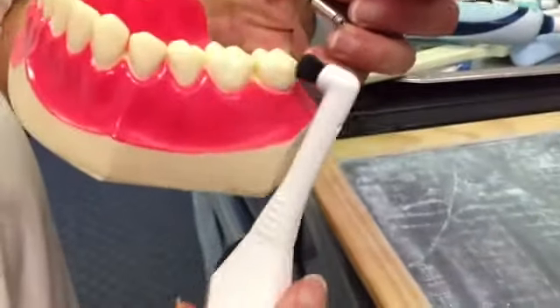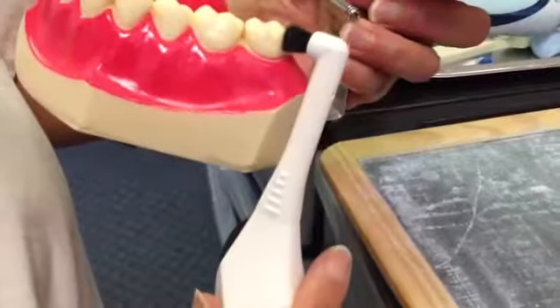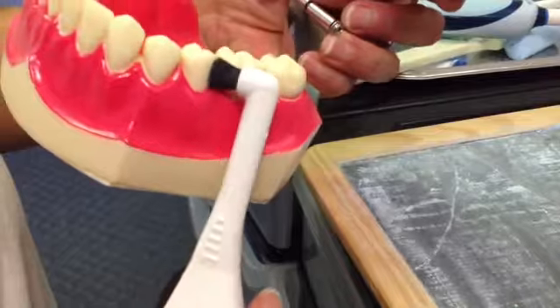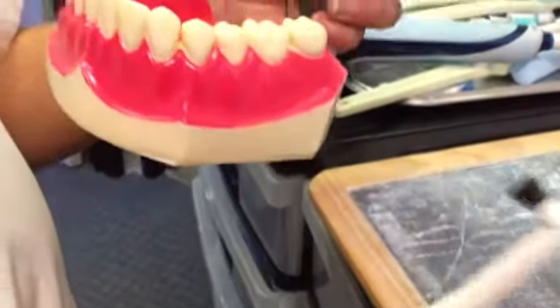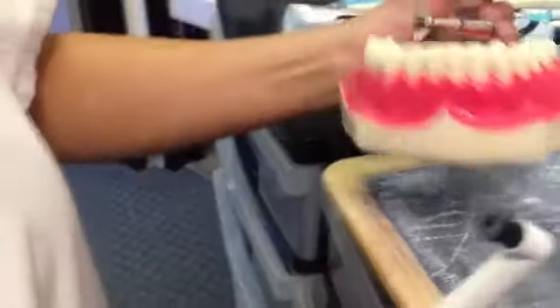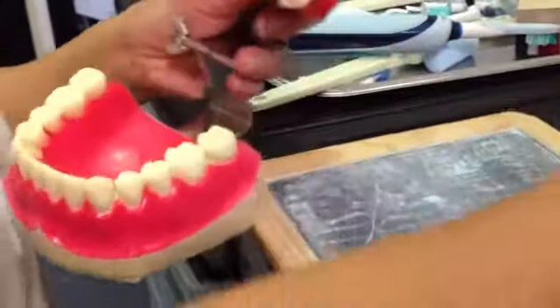So without touching the tooth, because it'll wear it. But you want to turn it like this, or go like this, and go like that. And if you don't feel like brushing, just let it do the job for you.